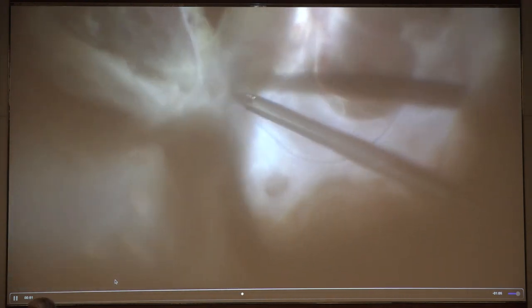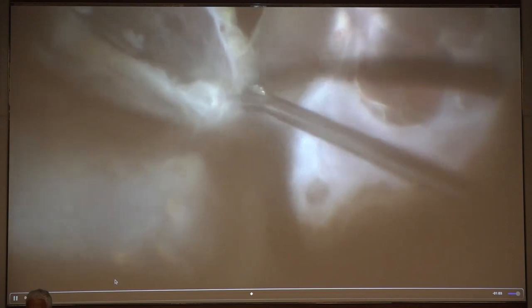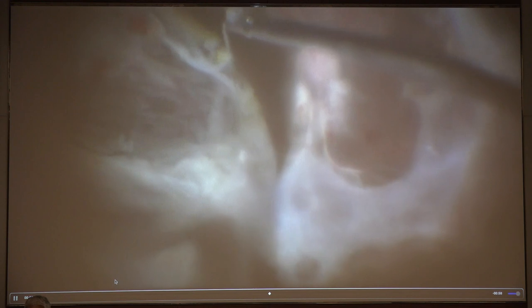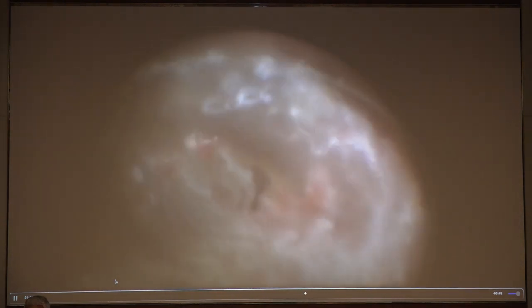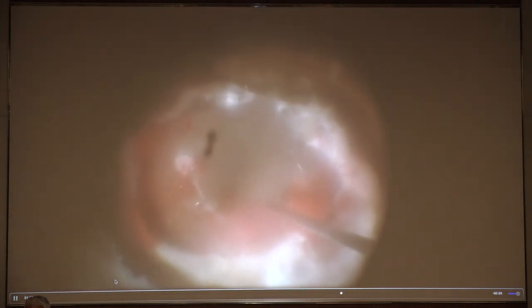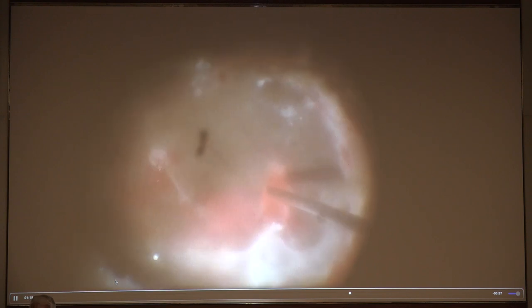If you cannot settle the detachment, it is almost an impossible case for me, because I have committed to the patient to settle his retinal detachment. I have to complete my surgery after settlement of the retina, but still the membranes were thickly adhered to the retina, and it was creating so many peripheral breaks. So I had to do the 360 peripheral retinectomy finally to settle at least the posterior pole. But the problem is there was a large macular hole. So what should I do?